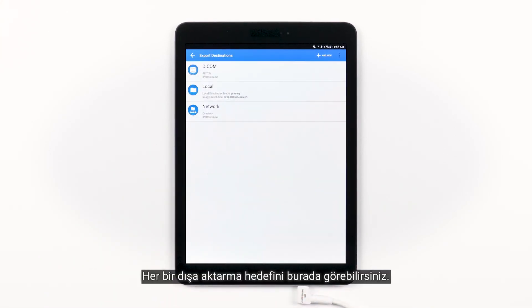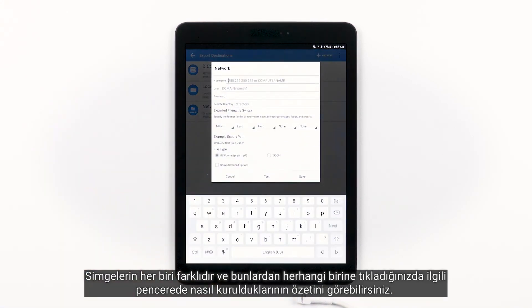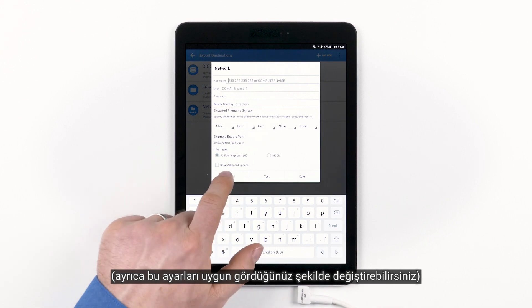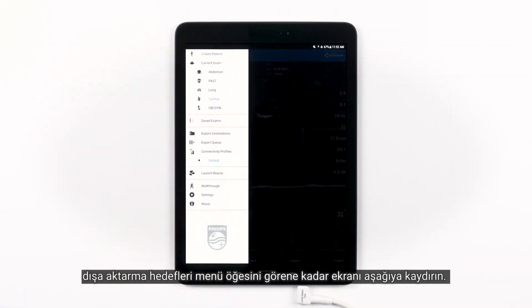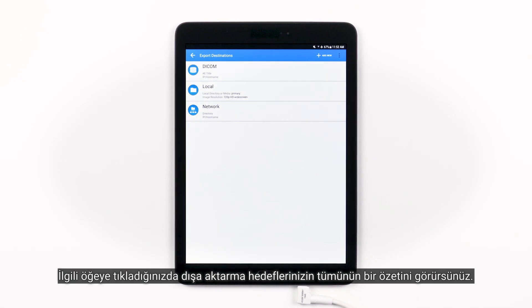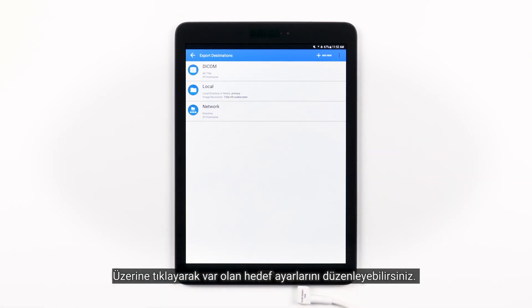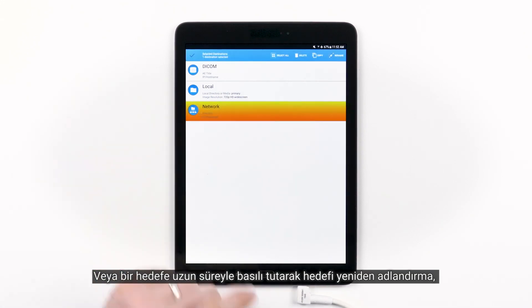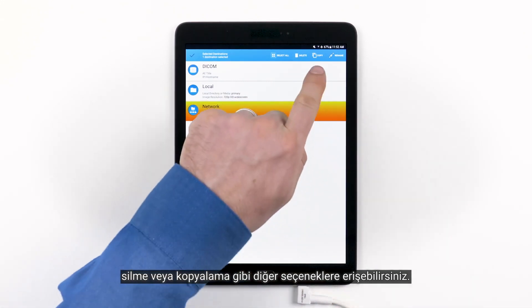You can now see that we have one of each export destination. Each of the icons are different, and by tapping on any one of them, you can see a summary of how they were set up. You can also edit or adjust these settings as you see fit. To access this view where you can see all of your export destinations, simply tap the menu and scroll down until you see the Export Destinations menu item. From here, you can add a new destination, edit an existing destination by tapping on it, or long press on a destination to access further options such as renaming, deleting, or copying a destination.